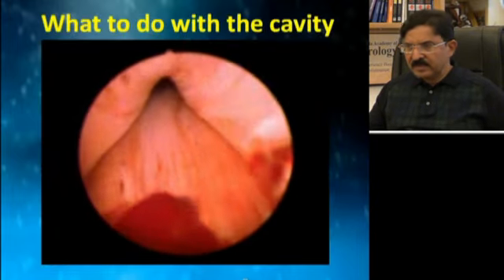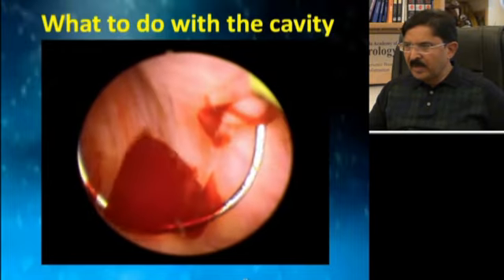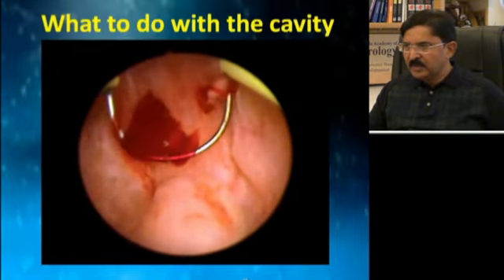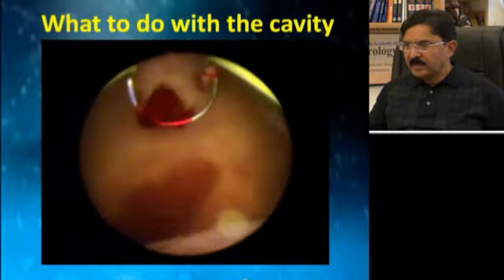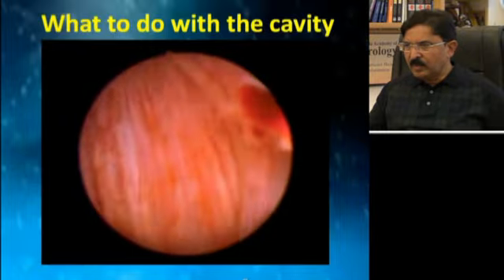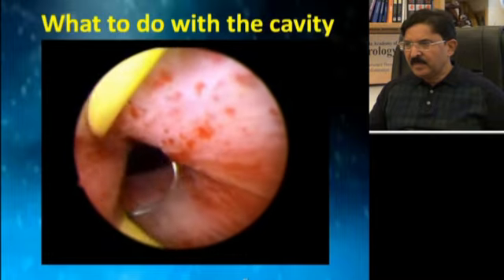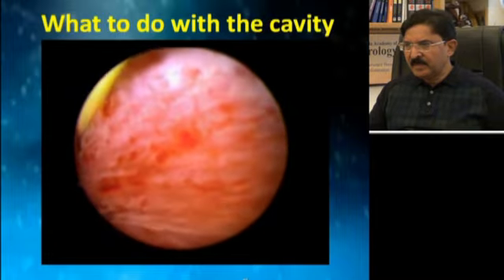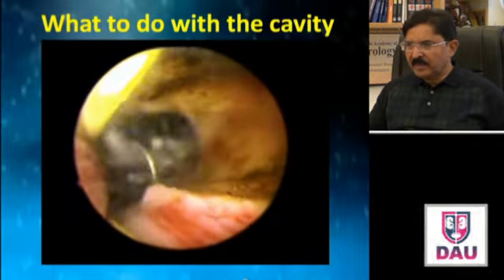Here we are doing this procedure, and you have to first orient yourself by looking at the veru montanum, the apical tissue, left lobe, and then this is the bladder neck, and this is the lumen of the bladder. You will appreciate that although this is a case of abscess, there is not much hyperemia and edema on the prostate as a result of antibiotic therapy. So you begin resection, you know this patient has an abscess in the left lobe.